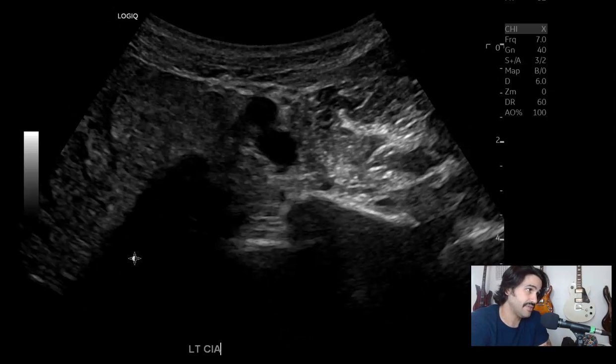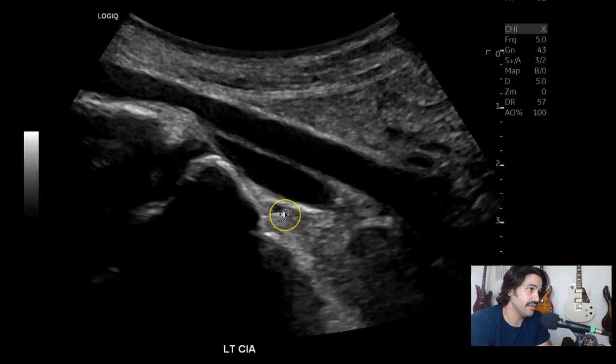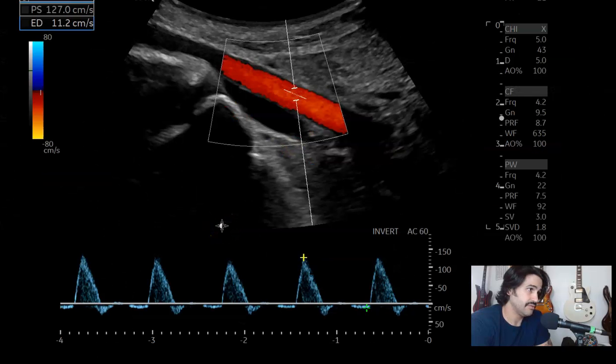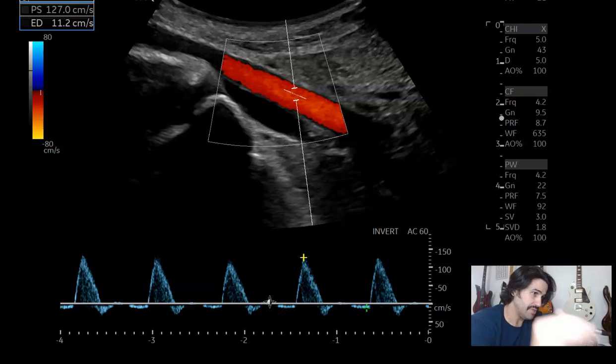And then left common iliac artery — common iliac artery, common iliac vein — transverse without color, sagittal without color. Measuring it, about 0.7 as well, all around. With color, spectral Doppler — again, nice triphasic waveform. You can see that last peak. If you lower the scale, or increase the gain a little bit, or lower the wall filter, you can bring it out more.